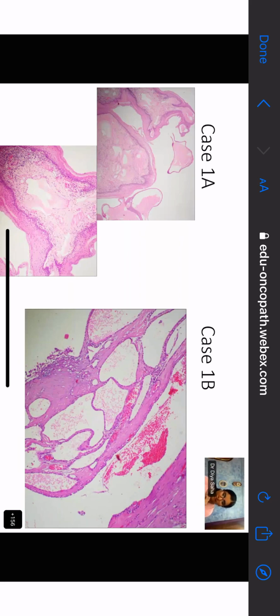So now have we come to the conclusion on how we use the word secretion? Of course, we often use secretion in a very colloquial manner. But if we want to be specific, it means an extracellular product of an epithelial cell. Yes, ma'am. That is what a secretion is. So now is everybody agreed that this on the left-hand side is not a secretion, or is it? Start from you, Diya. No, ma'am. It is not a secretion.